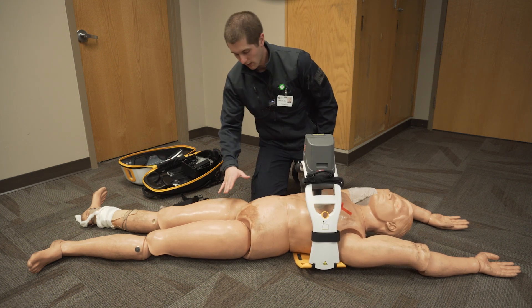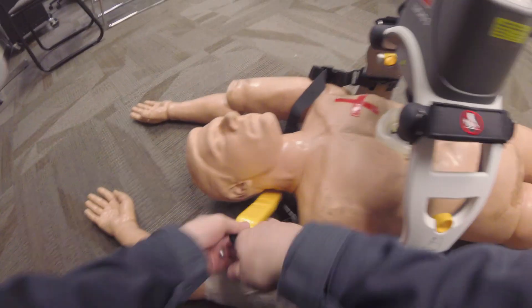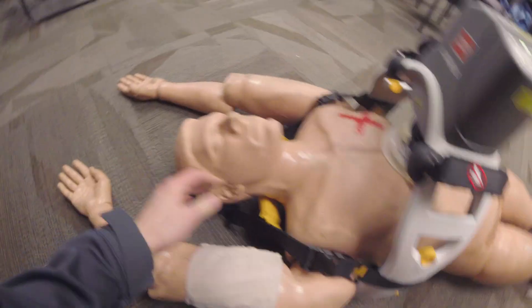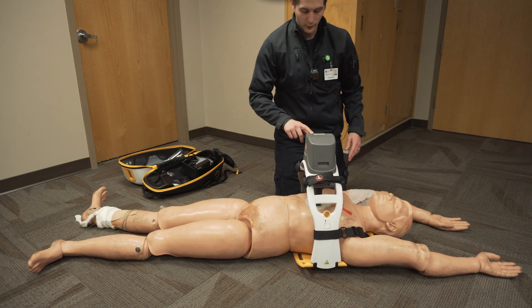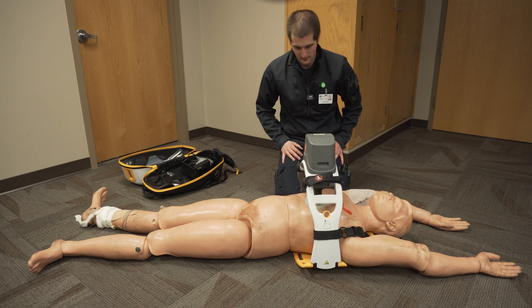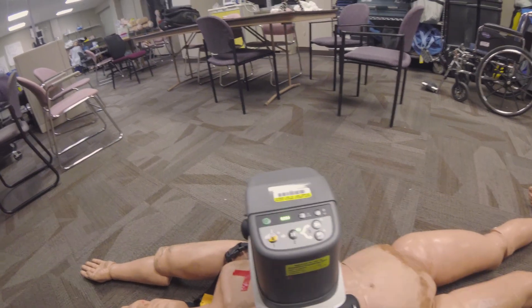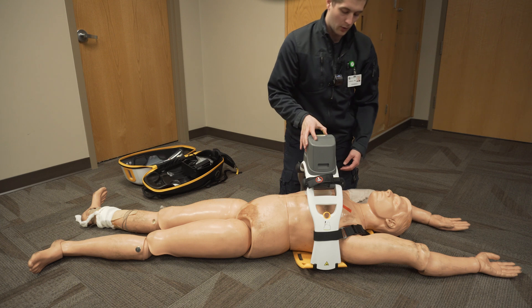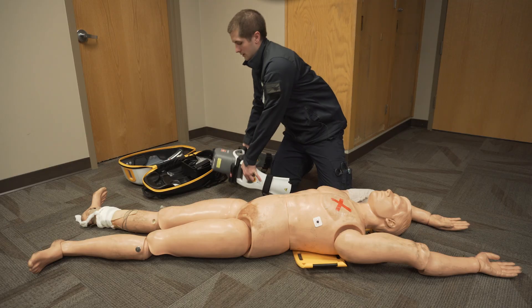Once that starts going, make sure it isn't going to ride down onto the stomach. Take the securing device and put it around the patient's head. When you hear the pause, ventilate — two breaths — and it's going to continue. Tighten the strap so it's not too tight, but enough to keep it from compressing the stomach. If you get an advanced airway, go ahead and switch it to continual compression mode — it will not stop for any reason during compressions. To remove this, go from setting three to setting two to pause it, then to setting one, break the seal of the suction cup and move it up, power off, remove the neck stabilizing strap, and unhook the Lucas device.